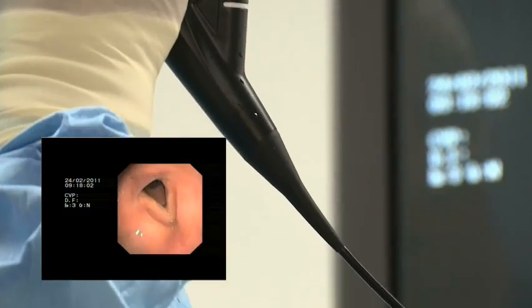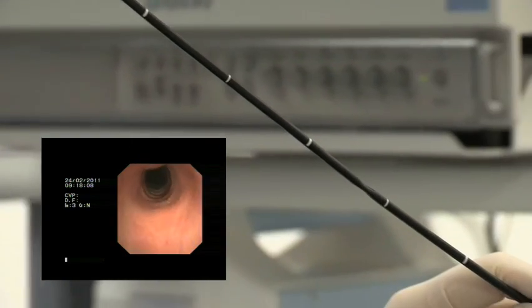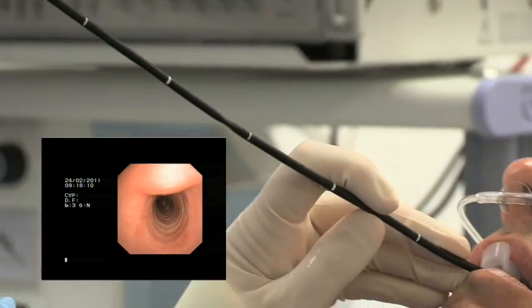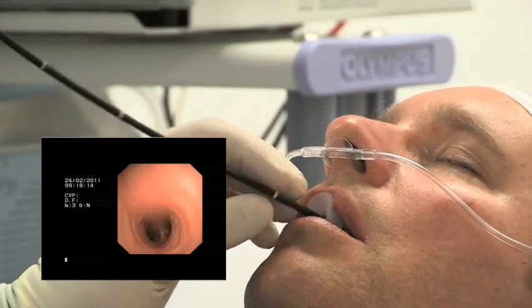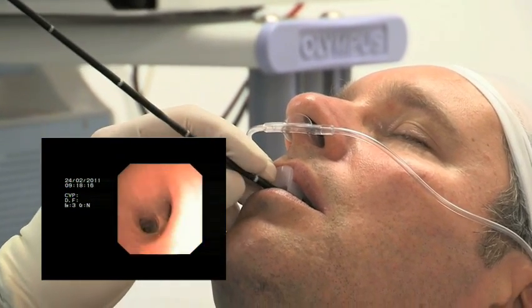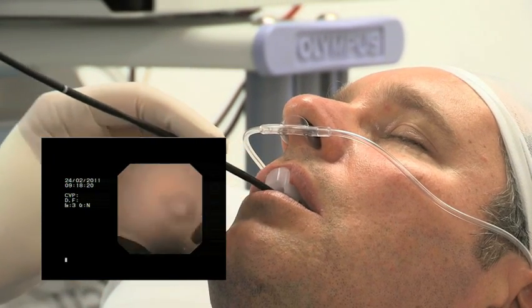For smaller patients, the maximum allowable dose of lignocaine may limit topicalisation. The nebulizer should be the first component of topicalisation to omit. We have found it to be the least valuable in volunteer training courses with colleagues.